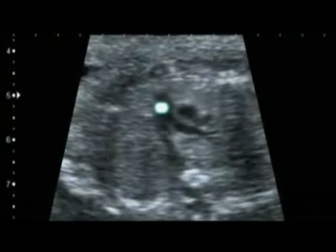Pulmonary valve, ductus arteriosus, right branch of pulmonary.